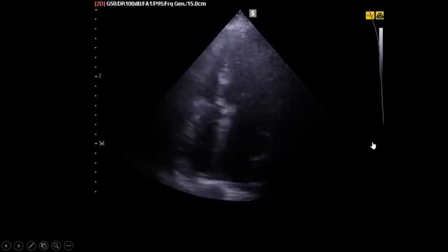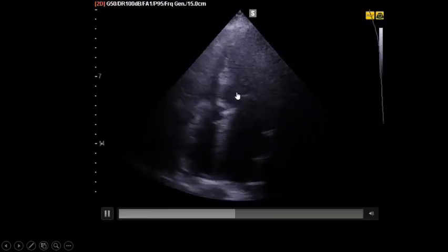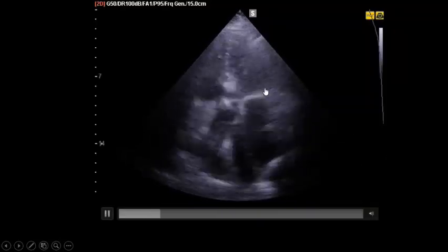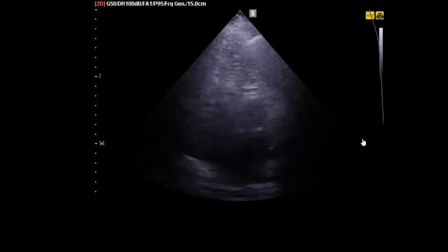I will look only at the left ventricle. I believe it's contracting properly. It's almost kissing. I am sorry for this hazy picture, but the patient was morbidly obese.